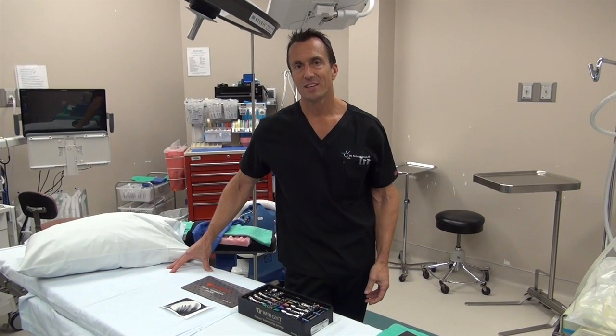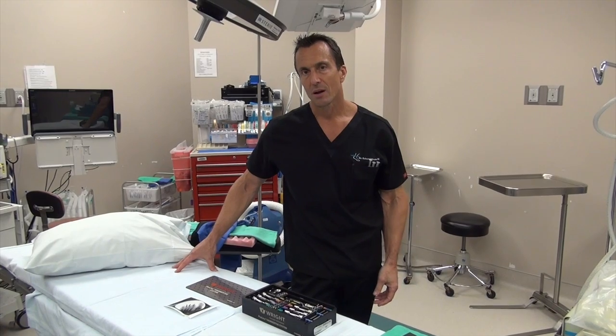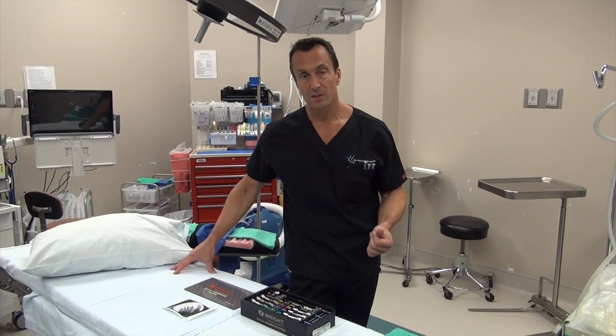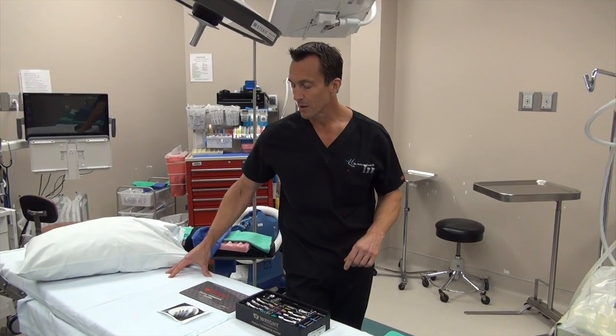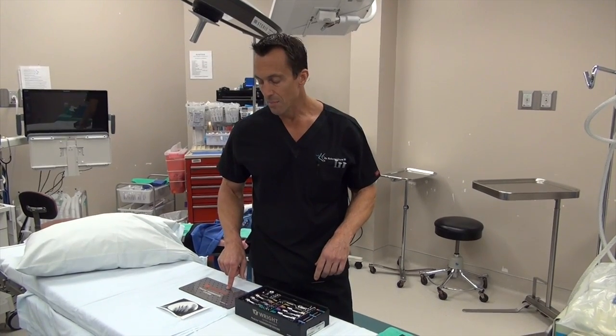Hi, this is Dr. Moore and today I'm going to show you a new hammer toe repair, toe straightening, and even toe shortening system called the Phalanx hammer toe system from Wright Medical.